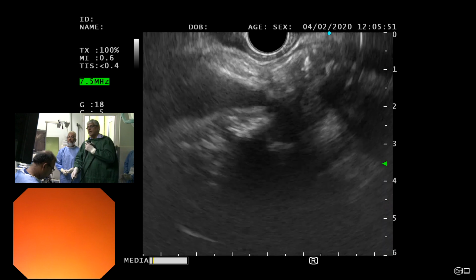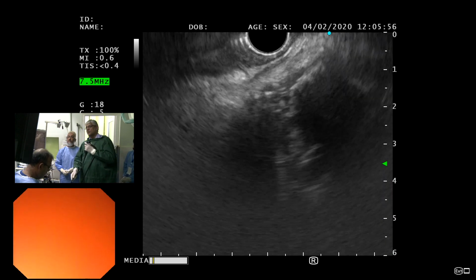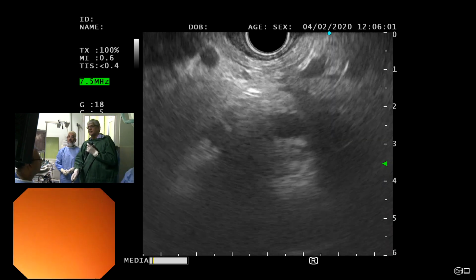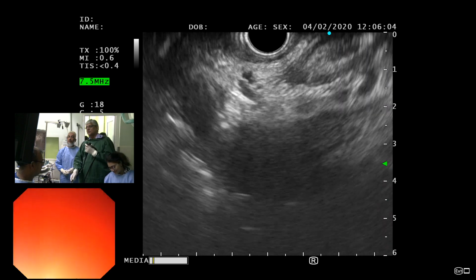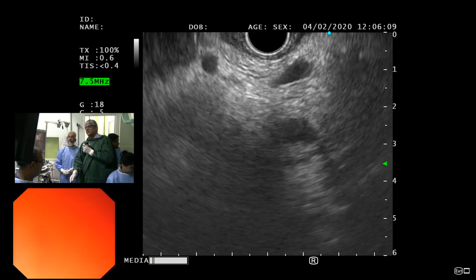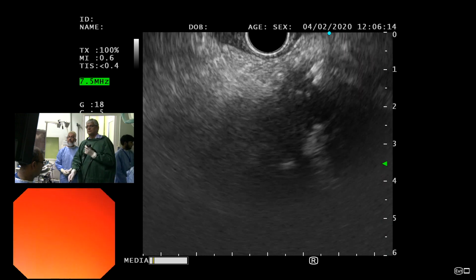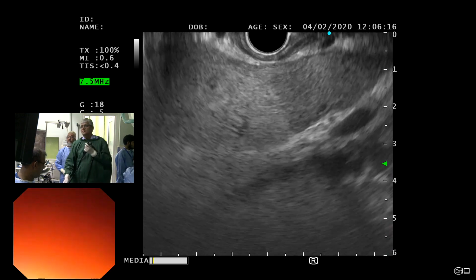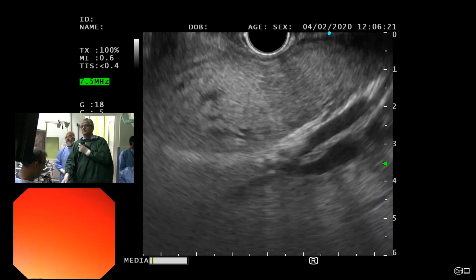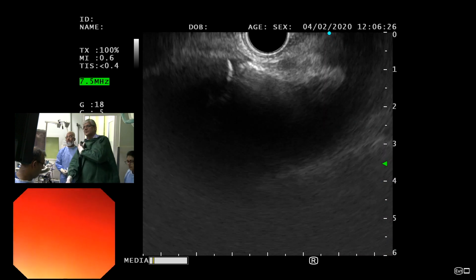Now once I've got this pancreas here, I'm going to just keep it in the middle and go whichever way I want to go. There's definitely chronic pancreatitis here. इसमें तो there is no question now, because once you've got such bad pancreatitis, you really can't see anything. Pancreas का. Let me see if we can see the kidney here. Where is the aorta? There's the aorta.